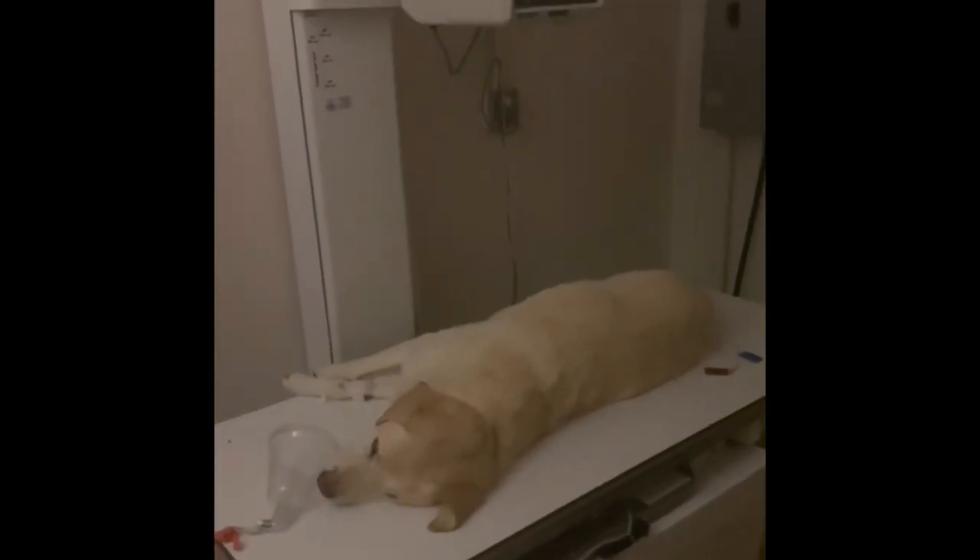Since he keeps popping his head up, I use bean bags to keep his head down. I don't put the weight on his neck, but around it. Next I'll extend his forelimbs and tie and clamp them in place.